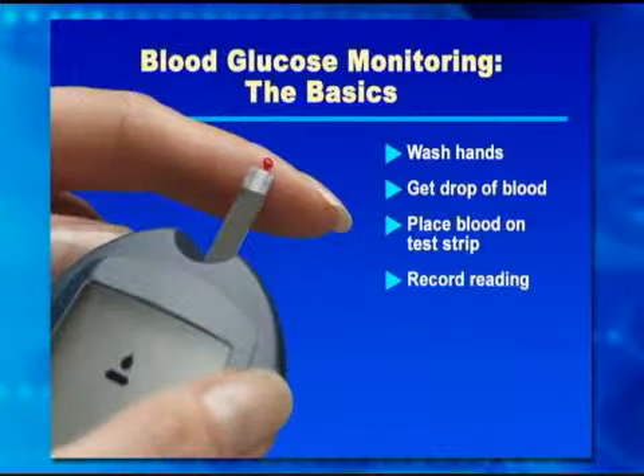Once you've applied the blood, most strips will wick the blood up inside, so you just need to touch your test strip into the blood. Then the number will show up.